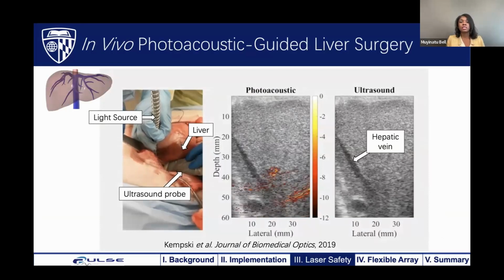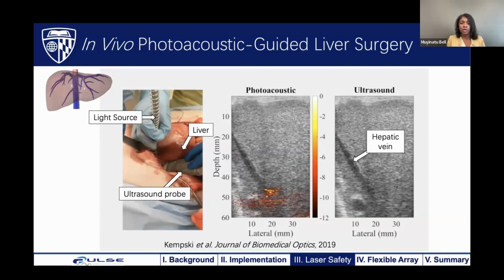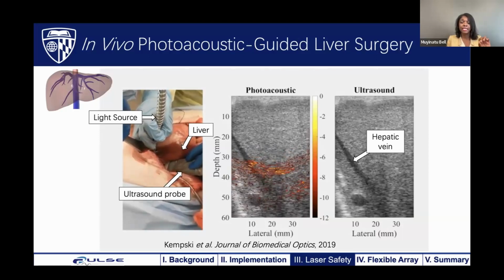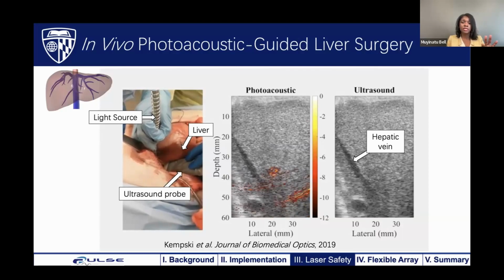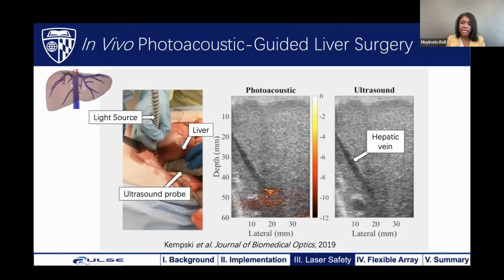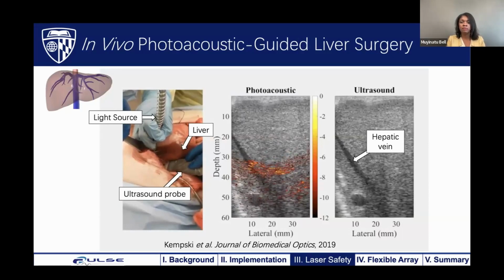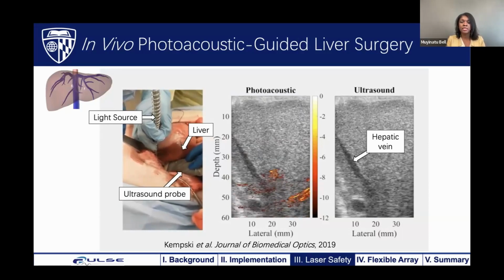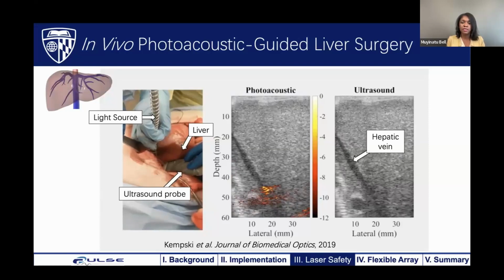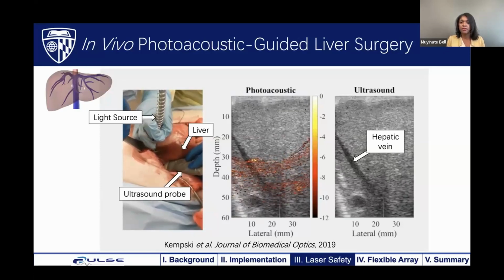If I have a light source, which in this case is operating independently, but remember, it could be attached to a surgical tooltip, and I navigate that light source around my surgical space, I could see that when the ultrasound probe is fixed, I get subtly different signals when I'm inside a vessel versus in the tissue surrounding the vessels. The signals are more focused when the light intersects a vessel, and they're more diffuse outside of the vessel region. And this is believed to be related to the presence of major vessels, which provide more focused photoacoustic signals, and minor vessels surrounding the major vessels that provide some level of signal, but the signal all blends together and provides more of a diffuse signal from these out of focus vessels.